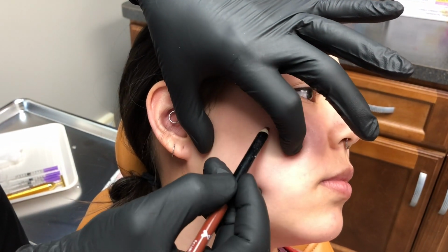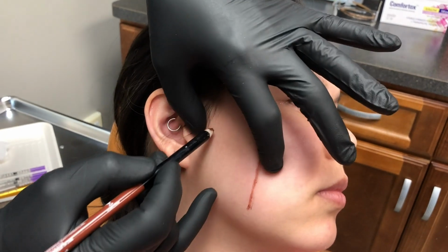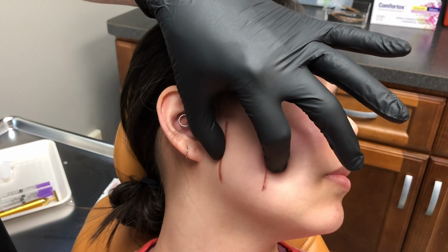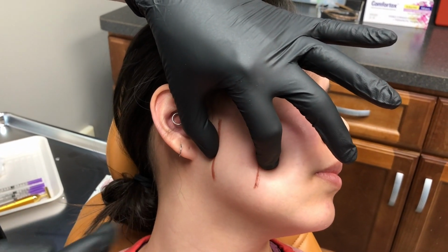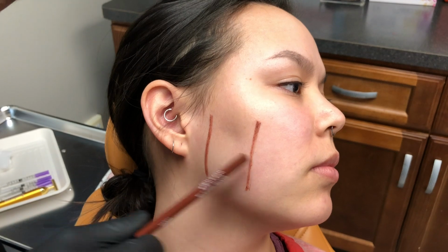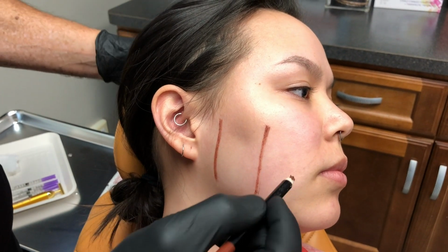So what I'm doing is outlining the anterior masseter, bite down again for me, and the posterior masseter. Generally when we teach in the AAFE to give this, we hold the anterior and the posterior masseter tight and go ahead and give her the injection of Botox. But here's where you really need to know your anatomy. When it comes to the AAFE and we teach good technique, it's about 3 things: anatomy, safety, and technique.